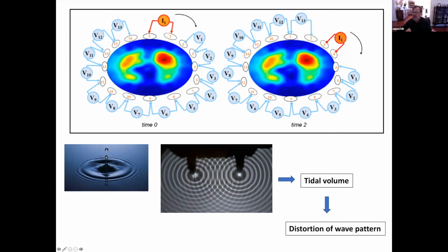And if we do this very rapidly, at a high frequency around the chest, we generate nothing else than a wobbly waveform pattern that, if the system is static, will have quite a nice network of waveforms interfering with each other. Then when we distort that pattern or network of waveforms with a tidal volume change, we get a distortion of this wave pattern.